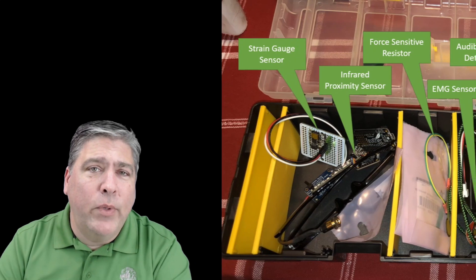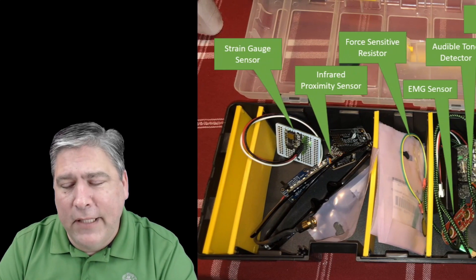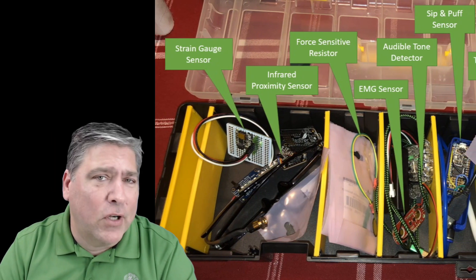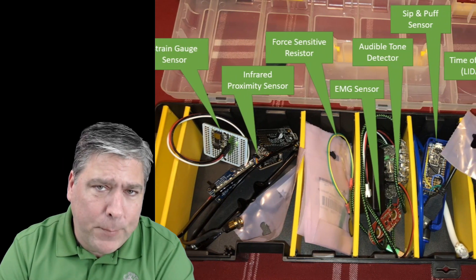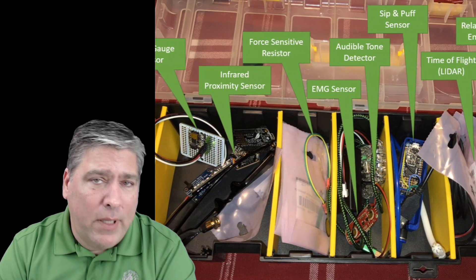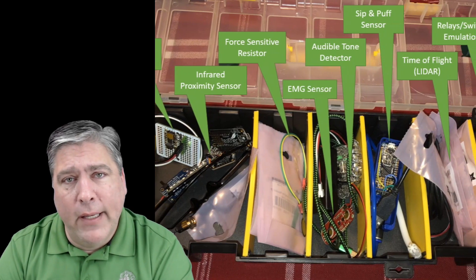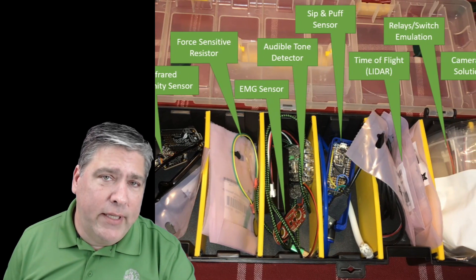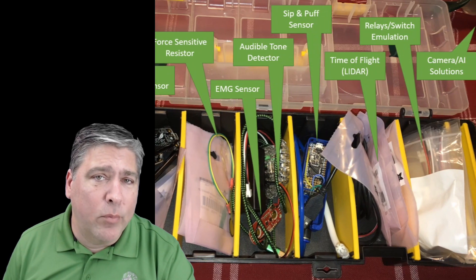Ella uses those switches for most of the freedoms that she has. We decided we were going to reach out and ask the Hunts if we could come up and try to find some replacement for the switches she used. Over the next week, I got ideas from around the country — everything from LiDAR sensors to different types of relays and FSRs and all kinds of sensors. All of them were possibilities; we didn't know which ones were going to work, so I assembled a kit.